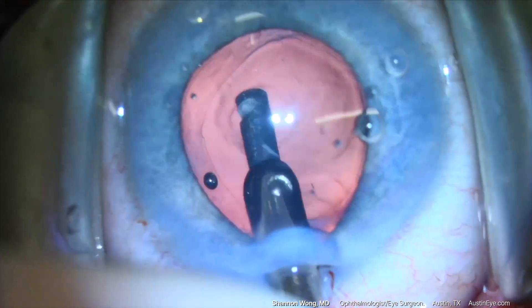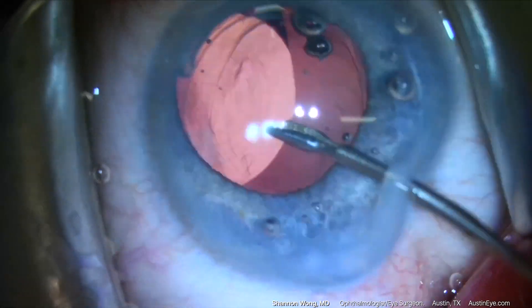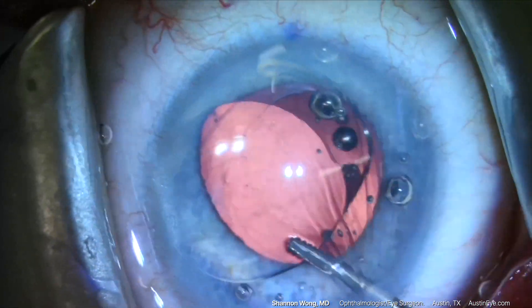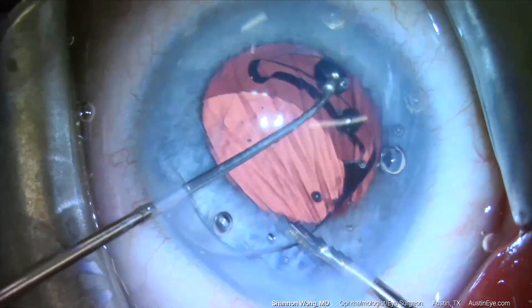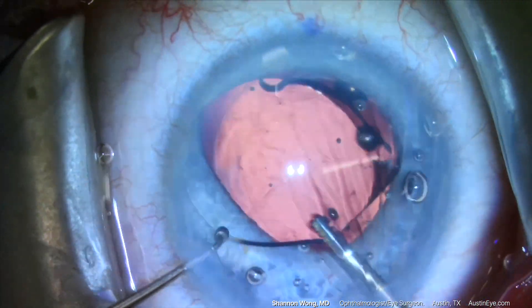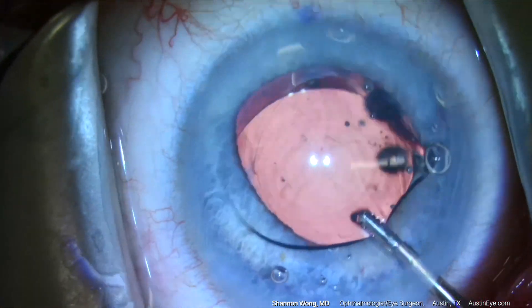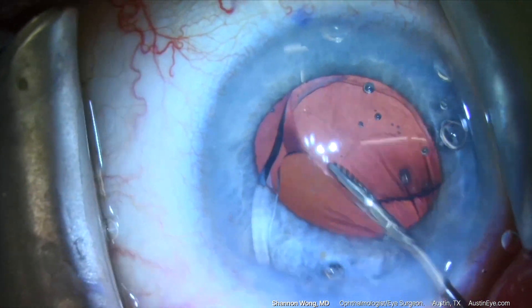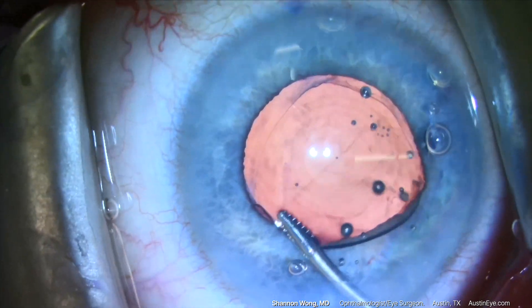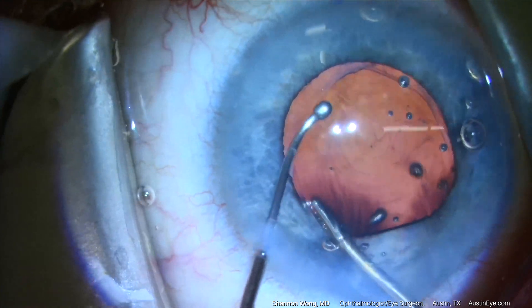An anterior vitrectomy is then performed. Insertion of the replacement IOL involves placement of the IOL anterior to the anterior capsule. Then we hold the edge of the optic with micro forceps and use a Conor wand to maneuver the lens haptics posterior to the anterior capsular rim. The lens optic is then maneuvered posterior to the anterior capsule. Once the entire lens implant is posterior to the anterior capsule, the optic edge held by the forceps is brought anterior to the anterior capsular rim.